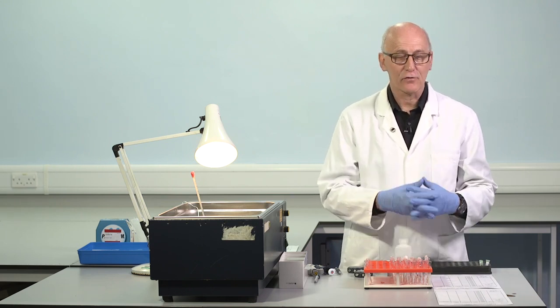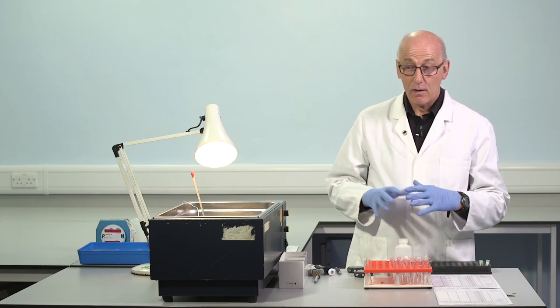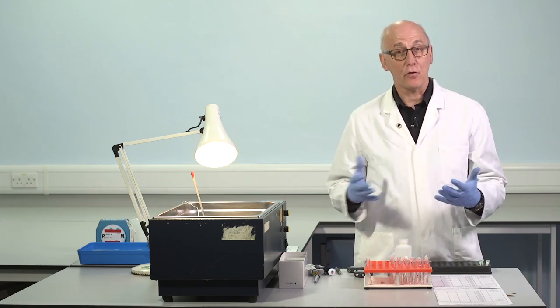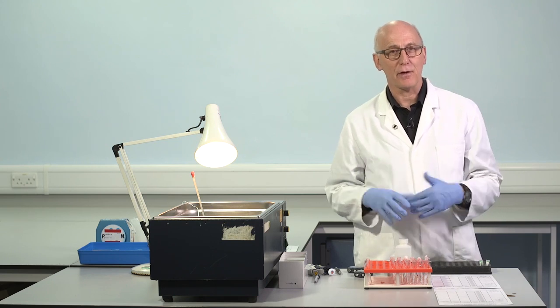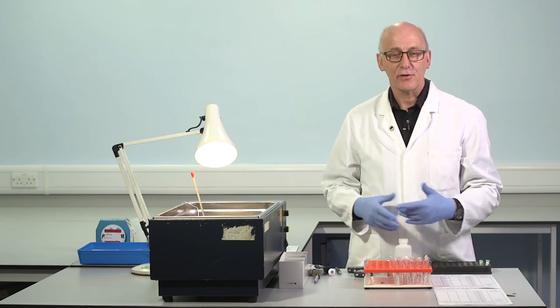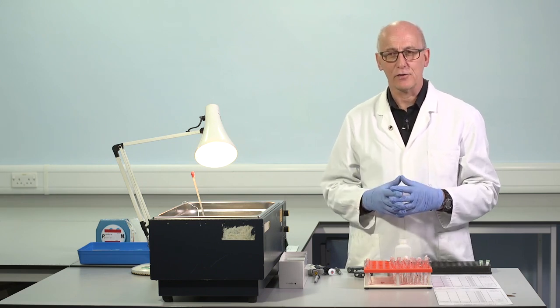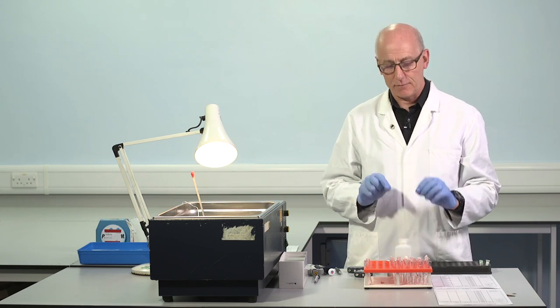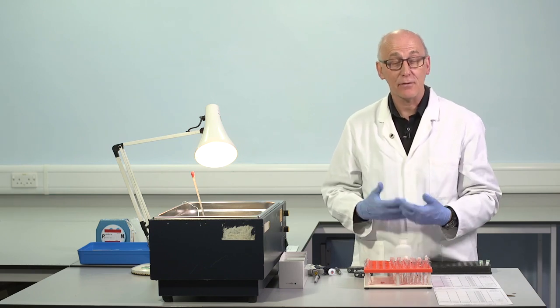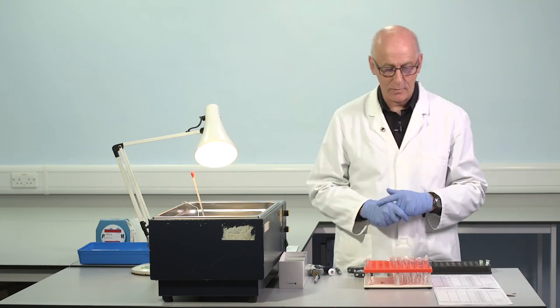The plastic tubes to construct the dilutions, these should be the same that would be used for a factor VIII assay. We're working in the water bath just now because we want to illustrate the principles. Of course, these factor VIII assays just now would be very frequently performed on auto-analysers, and that's perfectly acceptable. There's some advantages to that, improved precision and so on, faster processing, all advantages. But it's perfectly acceptable to perform this test in a water bath for patient management purposes. The precision is good enough, and I think we're lucky in hemostasis testing that that's true, that we're able to do this without expensive equipment.